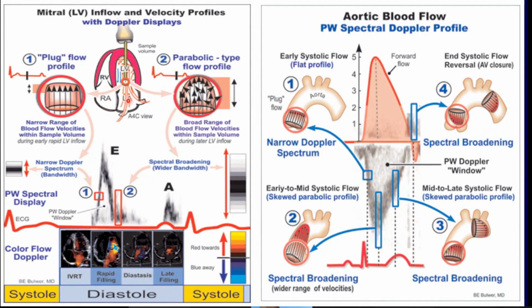Suppose we say 6 to 12 millimeters of mercury left atrial pressure, right atrial pressure is about 2 to 4 millimeters less, so it will be 4 to 8 millimeters. So this is low velocity flow, and for this you have to use pulse wave Doppler and actually reduce the color gain to be able to look at the left to right shunting across the atrial septal defect.